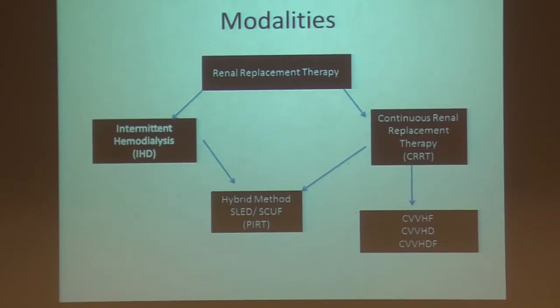When you see a regular dialysis machine, that's IHD, intermittent hemodialysis. This form of dialysis is usually between 2 and 4 hours, and this is what everyone thinks of when they think of dialysis. The main thing is blood flows. In an intermittent hemodialysis machine, you're running anywhere between 300 and 400. Patients in the chronic unit, we run their blood flows at 450 through an access.